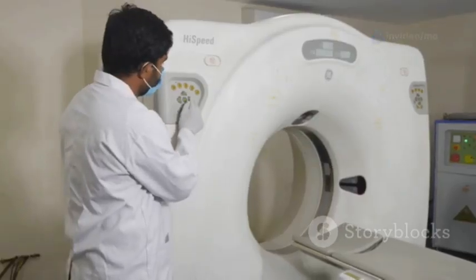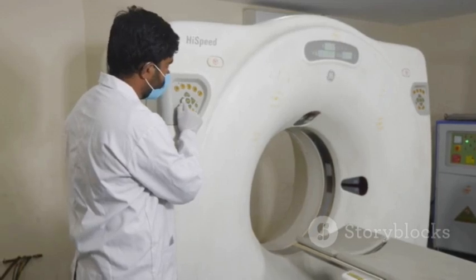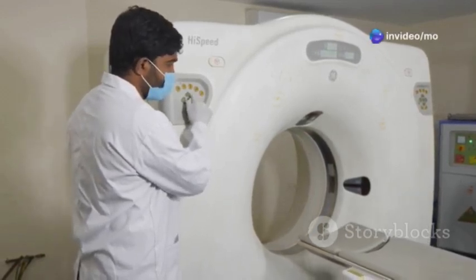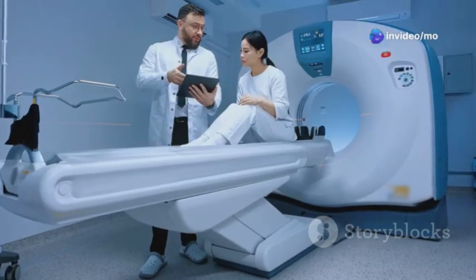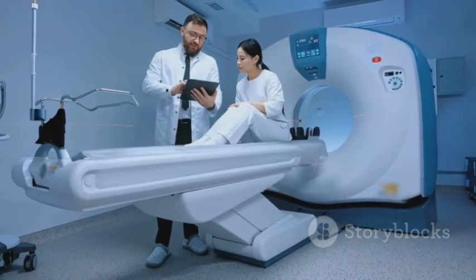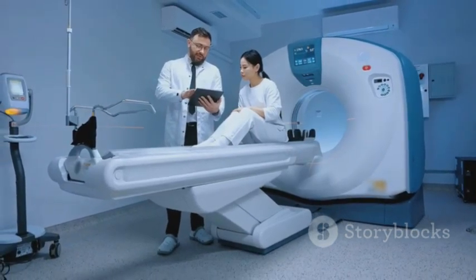The amount of radiation used in a CT scan is carefully controlled and kept as low as reasonably achievable, ALARA, to minimize potential risks. However, it's essential to discuss the benefits and risks of a CT scan with your doctor, especially if you are pregnant or have concerns about radiation exposure.